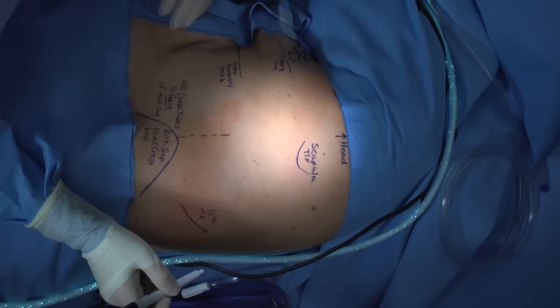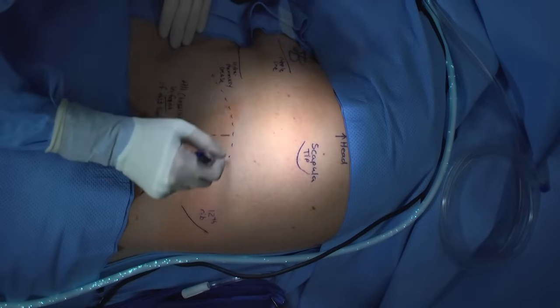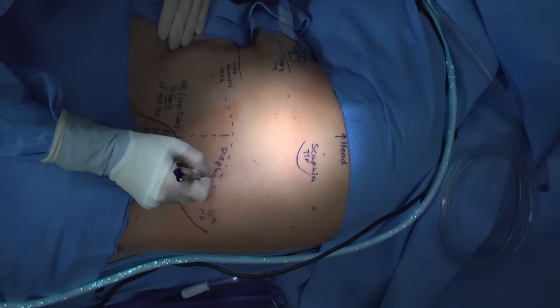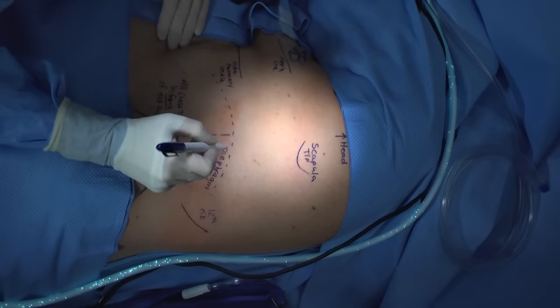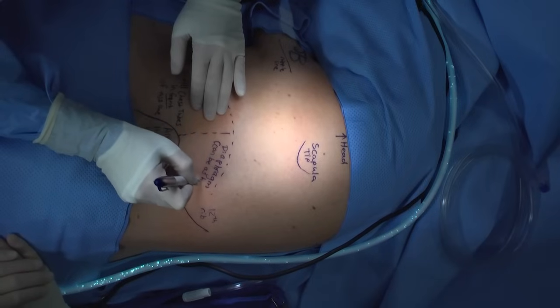Identifying the 12th rib will help you approximate the lie of the diaphragm. Remember that the dome of the diaphragm can be as high as T4 or even more elevated in certain disease processes, including diaphragmatic paralysis and diaphragmatic eventration. It is essential to know your patient's history and to review your radiology very carefully before beginning your procedure. Sometimes having the chest x-ray on the screen in the room is also very helpful.